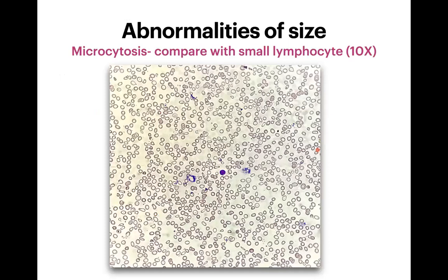This image taken at 10x shows a large number of RBCs for assessment. Here I searched for the smallest lymphocyte. Compare the nucleus size of this lymphocyte with the surrounding RBCs — all of them are microcytic. This is a case of microcytic hypochromic anemia due to iron deficiency. The key technique: focus at 10x, find the smallest lymphocyte, then compare the RBC sizes.